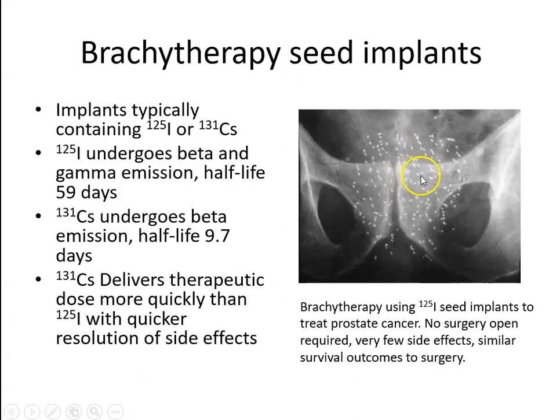and these iodine or cesium beads are usually emitting beta emission as the main cause of cell death here. So half-life of, in this case, 10 days. So these things will emit radiation for a period of time, and then they will effectively go cold.